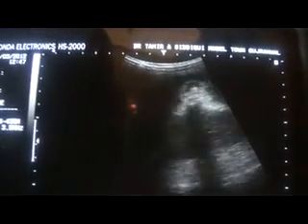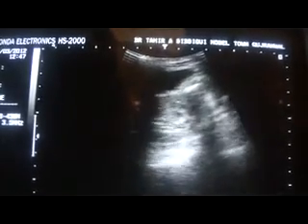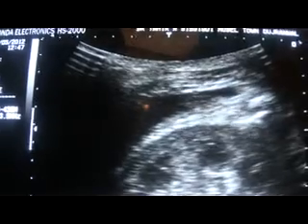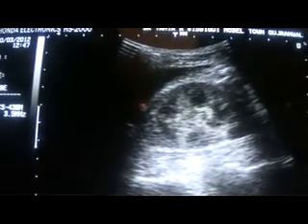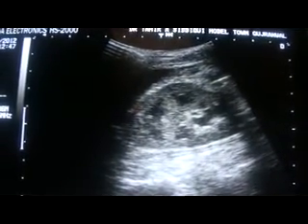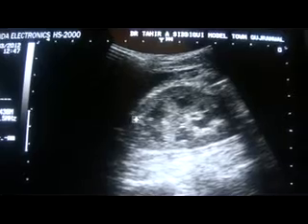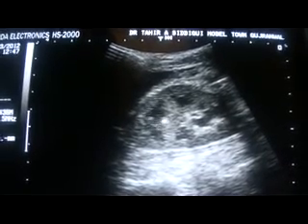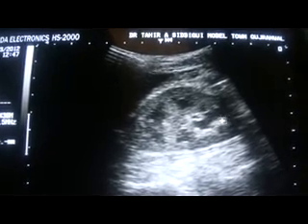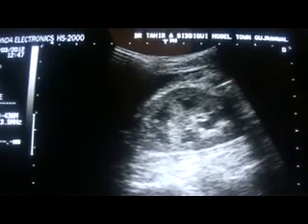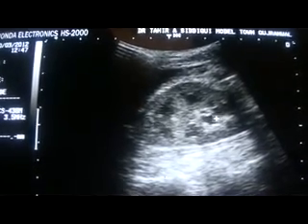Now subcostal — look at my scanning angle. I am scanning from the mid subcostal region, angling the probe cranially towards the patient's thorax, and I see this picture. This is the liver, this is the fluid — the black area you are seeing is fluid in the pleural cavity. This echogenic area you are seeing within the fluid is in fact lung tissue floating in the fluid.